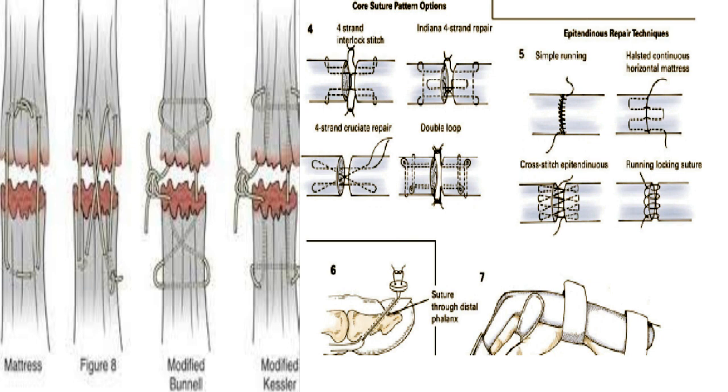Depending on the location of the laceration, the proximal tendon may retract and require maneuvers to retrieve it. Retrieval should be atraumatic and under direct visualization if possible. Flexing the wrist and elbow and squeezing the muscles of the forearm can help deliver the proximal stump to the incision. Sometimes counter-incisions proximal in the palm or forearm need to be performed to identify the tendon. Generally, the distal segment is identified easily with finger flexion. In multiple tendon injury cases, care must be taken to confirm the anatomy and orientation of the proximal and distal tendons.